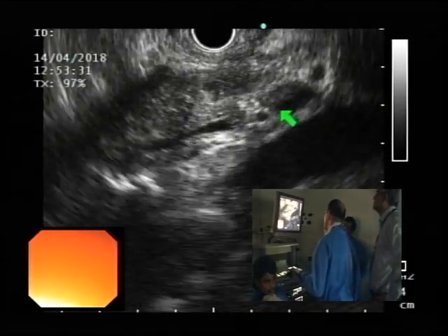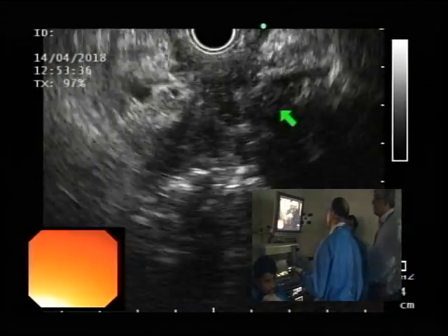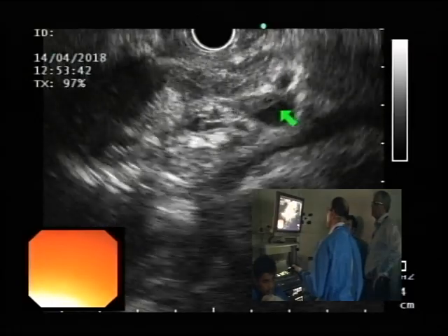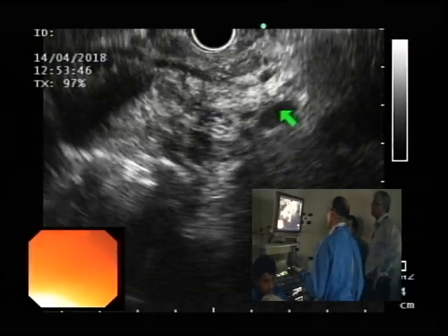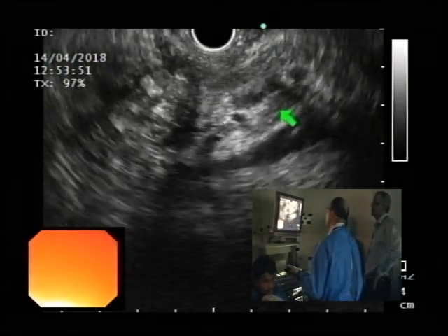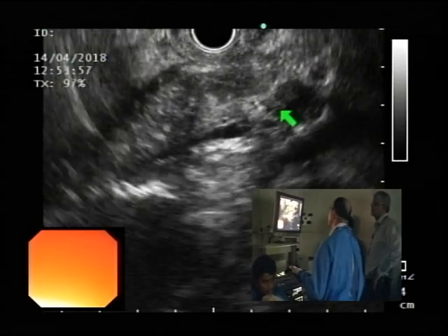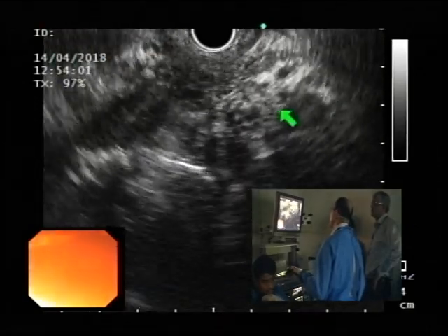What I can't understand is the correlation, or the lack of correlation, with your ERCP findings. I couldn't understand what was going on here because we couldn't get to the main papilla. If there is a lesion in a pseudo divisum, the dorsal duct can become prominent and open up, but I don't see the dorsal duct there. Yeah, I have not been able to identify it. The other thing is when he cannulated through the dorsal, it wasn't dilated. So that's where the disconnect comes.